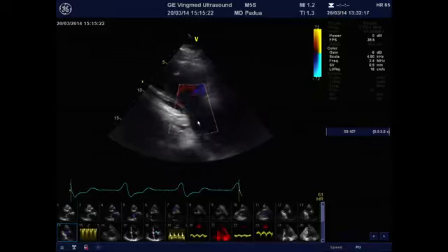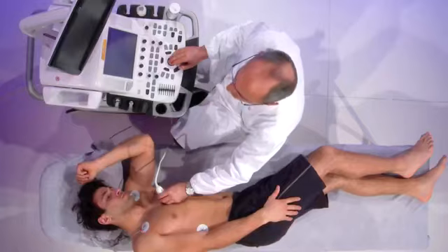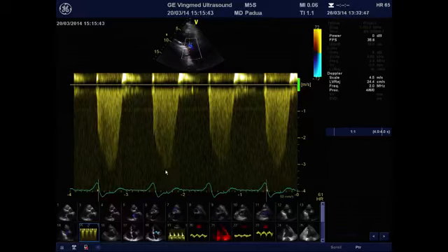Not only should the tricuspid regurgitation be checked in terms of color to look at the complications of biopsies, but it is also very useful to use continuous wave to sample the tricuspid regurgitant jet to obtain the maximum gradient between the right atrium and the right ventricle to derive the pressure in the pulmonary artery. This is, again, an important parameter to monitor.